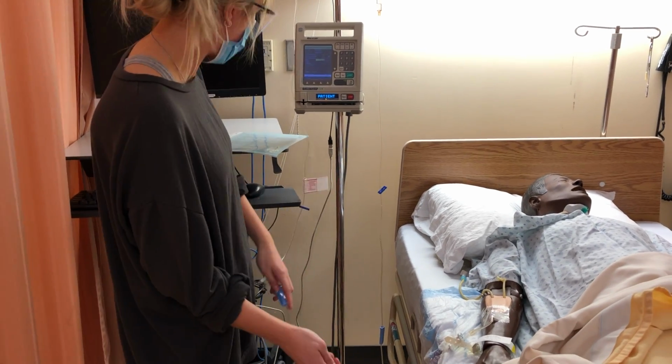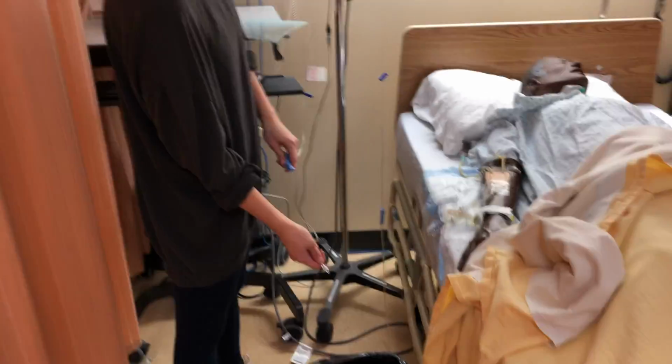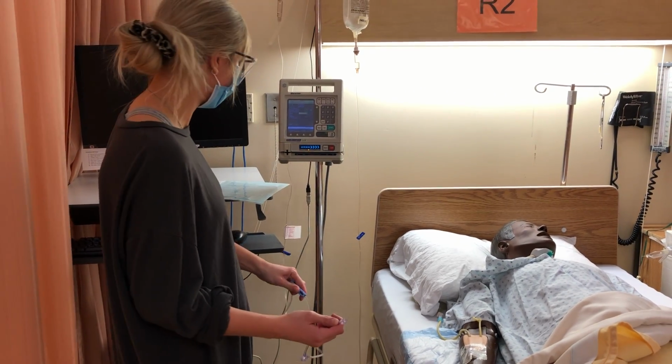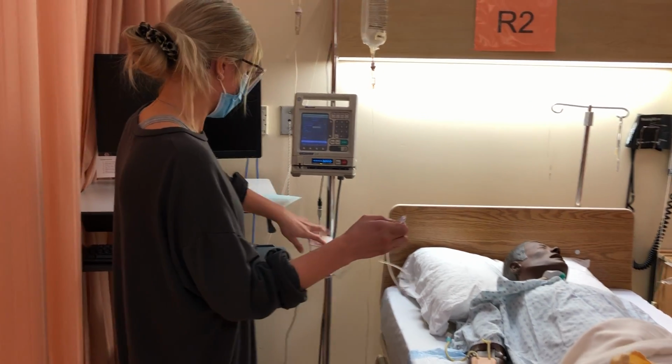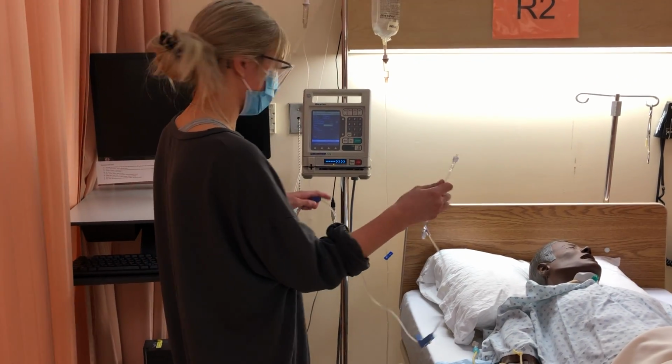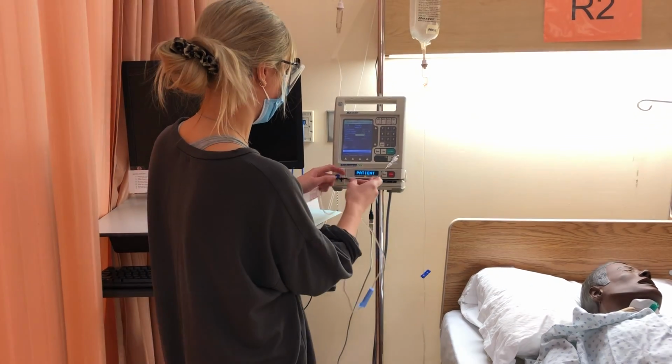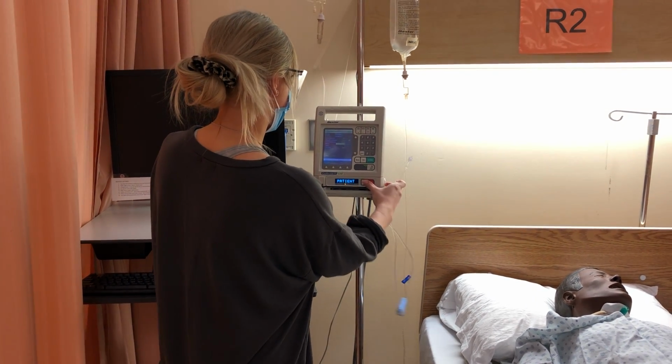So see the green light is infusing, everything is good. Okay. So the patient has their line primed all the way to the end here. I'll clamp that off, there's the green light, this is locked. And now just making sure I'm keeping sterile here. So we've already gone through our stuff here. It's good. What position? Again, one last time.